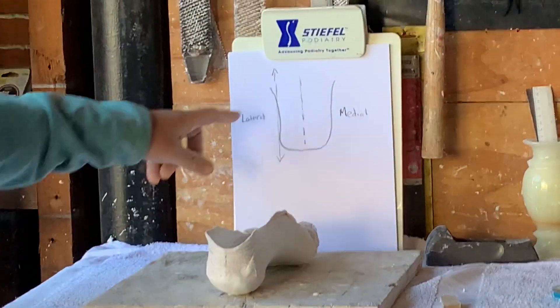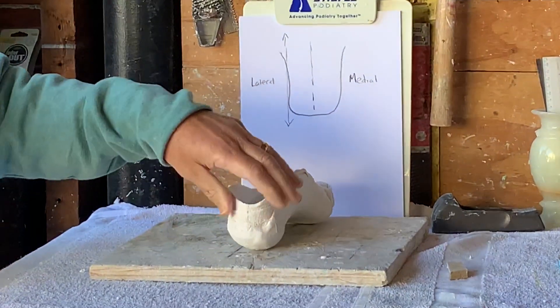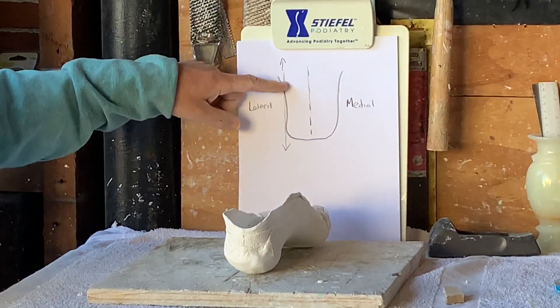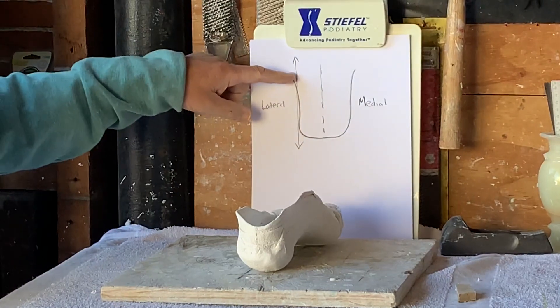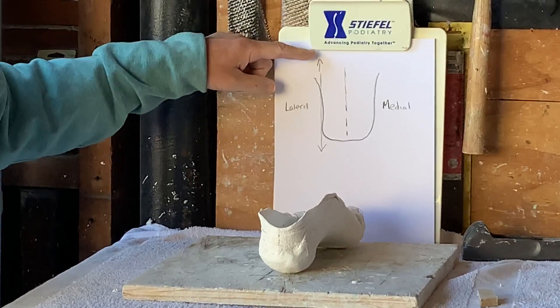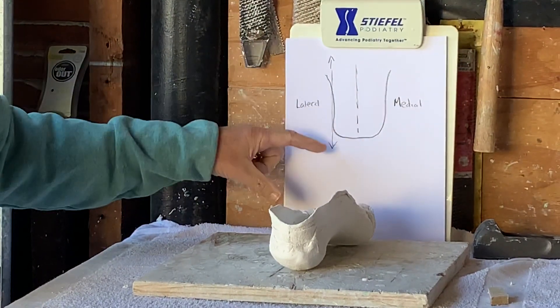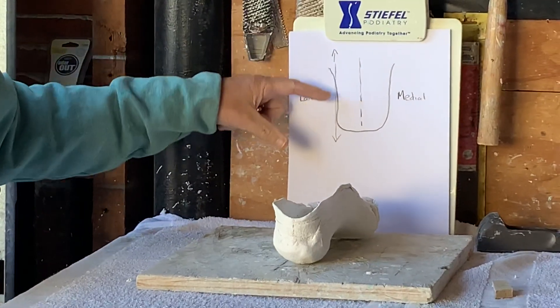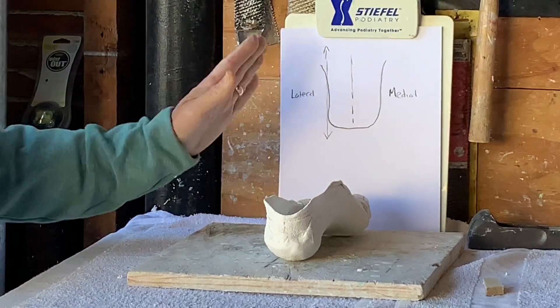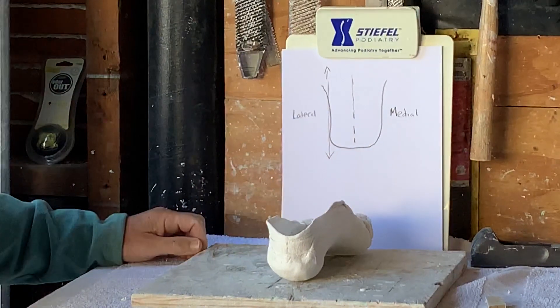So when we're looking at the back part of the heel, you'll find a curve along this lateral side. You want to line that curve up, actually a tangent through that curve, so it's perpendicular to the supporting surface.